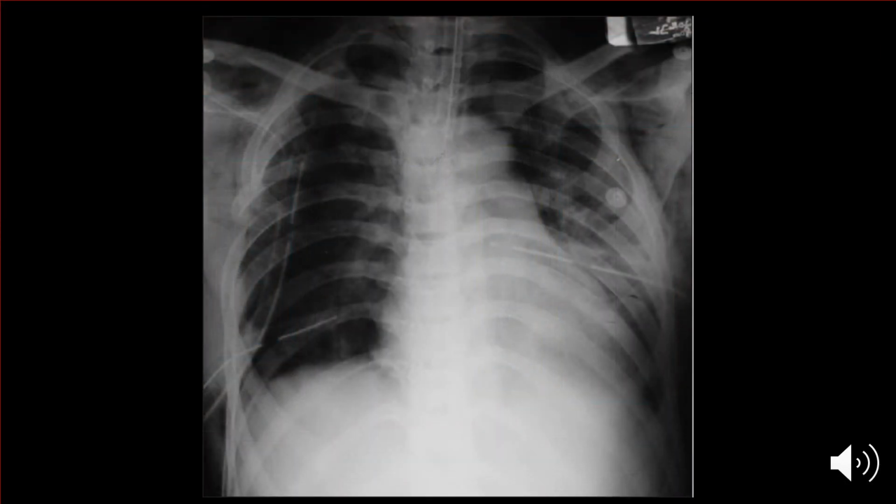All right, so this is a patient with chest tubes in. How many do you see? Perfect. Right, 3. 1, 2, and 3. Now, look at the one on the inferior aspect of the right lung. Is it broken there? Do you see that? You see that break in the white line there?